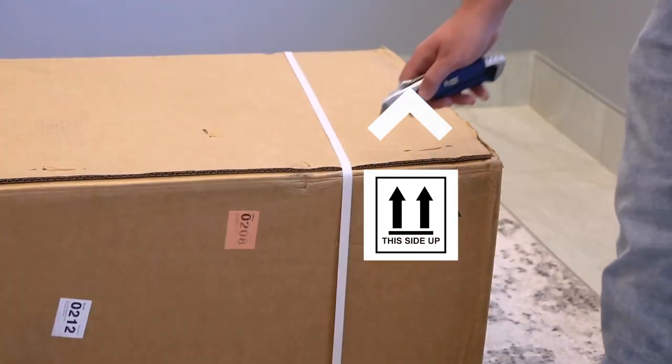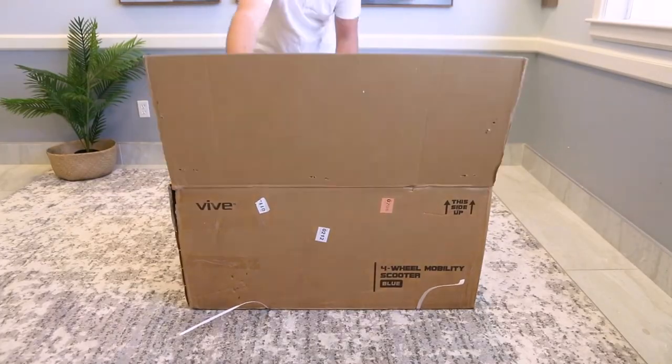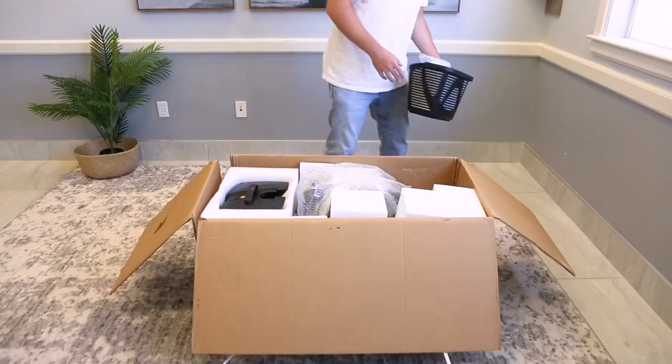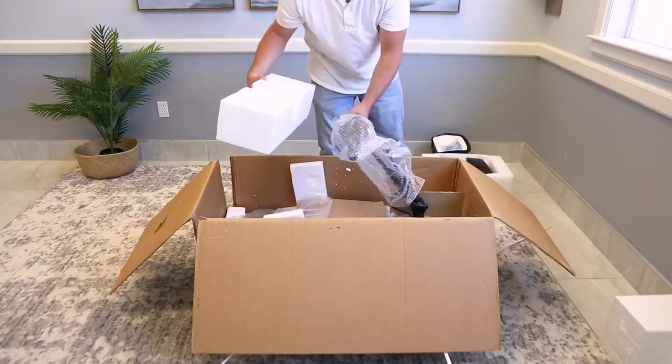To get started, be sure the box is facing up and cut the zip ties binding the box. Then open the flaps. Inside, you'll see the manual and scooter battery on top. Feel free to use the manual at any time during the assembly. Take out the basket and battery and set them aside — you'll need those later. Remove all packing materials that are on top.